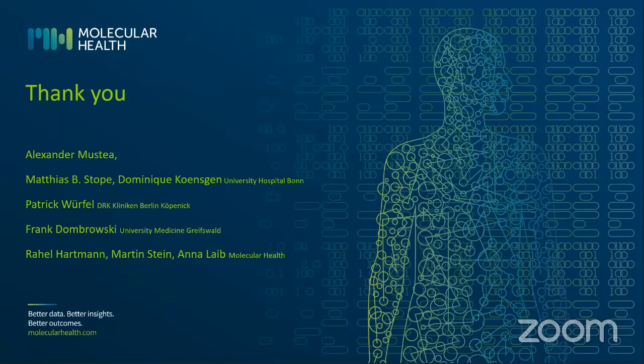In this case, we decided that we would probably not show anything that is based on MSI calling or CNA calling on samples that have very bad quality. Fortunately, I think this is not the average quality of data we get. But on the other hand, I think it is very good to have data of a wide variety of quality, to get an idea of where the limit is up to which you can still make reliable statements.